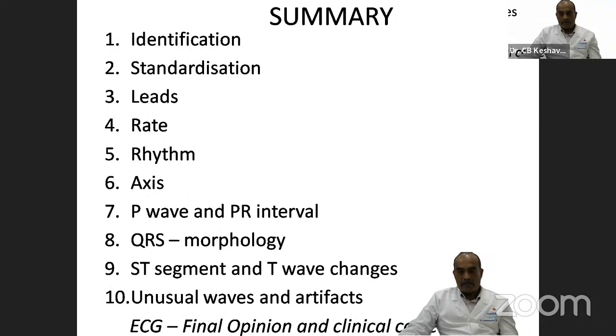If you see the patient, ask his history, get a grasp of why an ECG has been taken, whether the patient has palpitations, chest pain, whether he has presented to the emergency room with an acute myocardial infarction. If you see the clinical setting, then diagnosis will be easier, and always try to correlate between the patient's symptoms and the ECG. Many times it may not be possible.